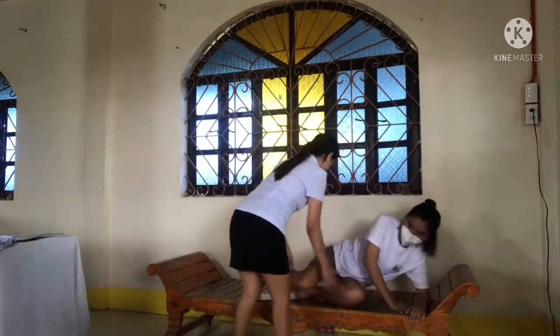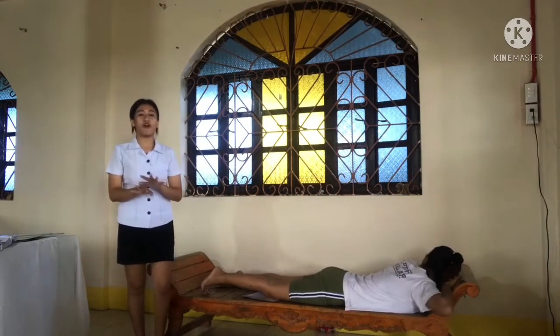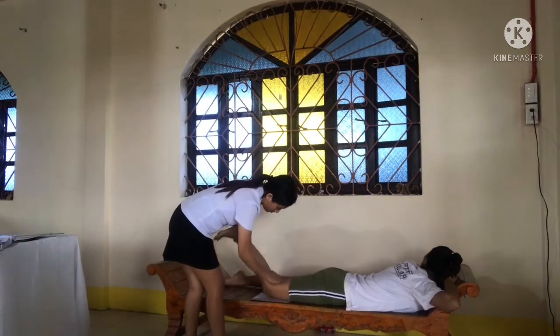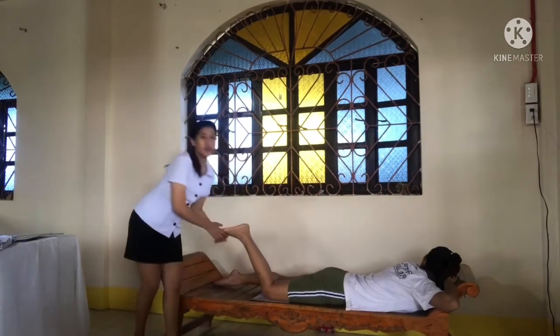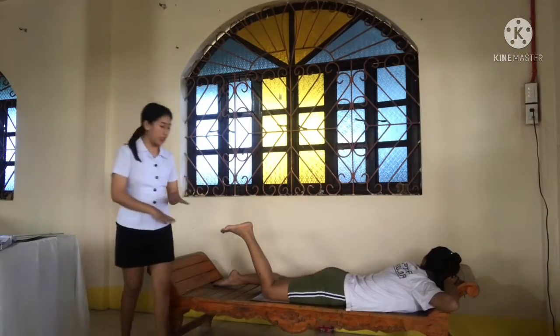Lengthwise. So, place the patient in prone position and adjust the body so that it is not rotated. So, flex the patient's knee to either a 40 or 50-degree angle and rest the foot on a suitable support. So, center the upper half of the IR to the knee joint and the central ray angulation projects the joint to the center of the IR.